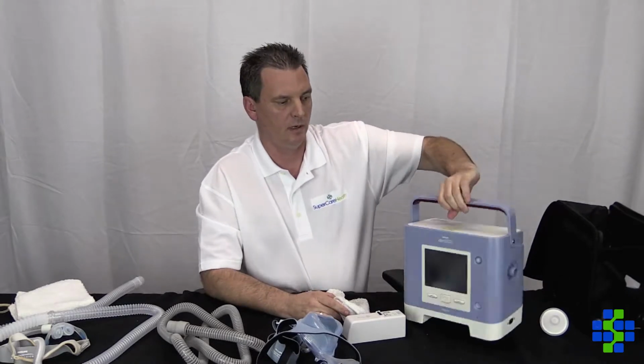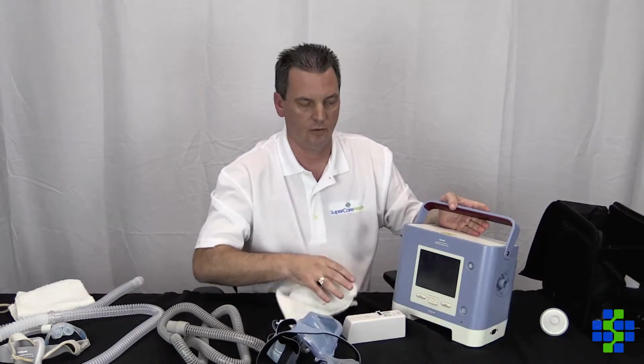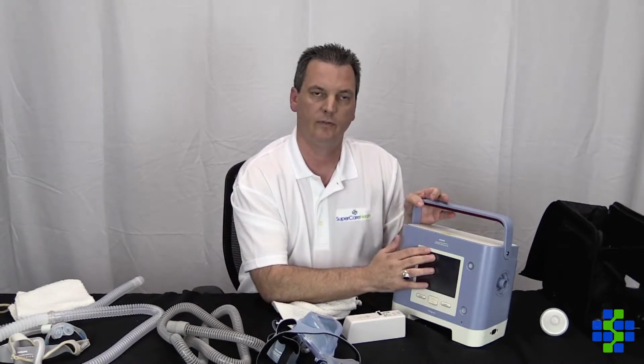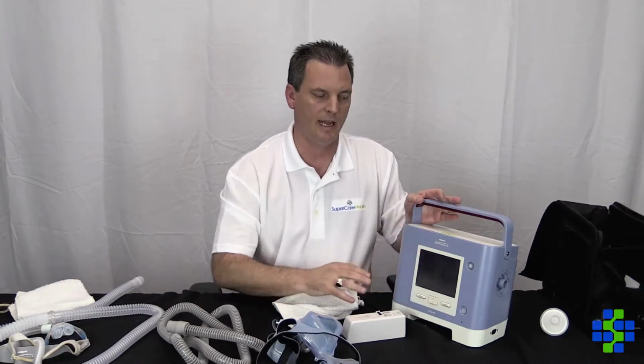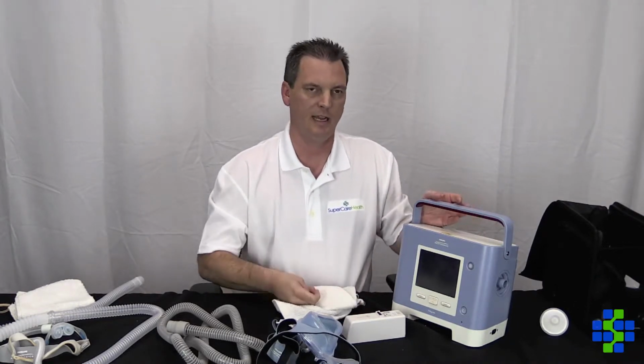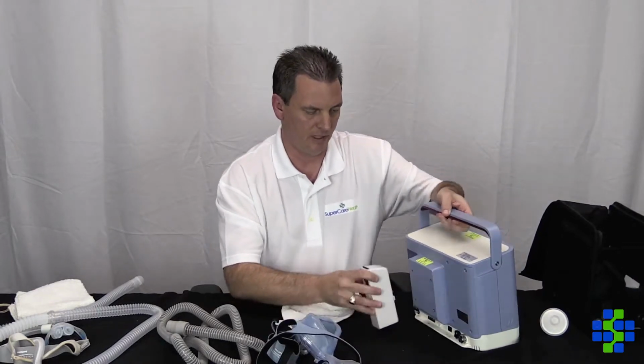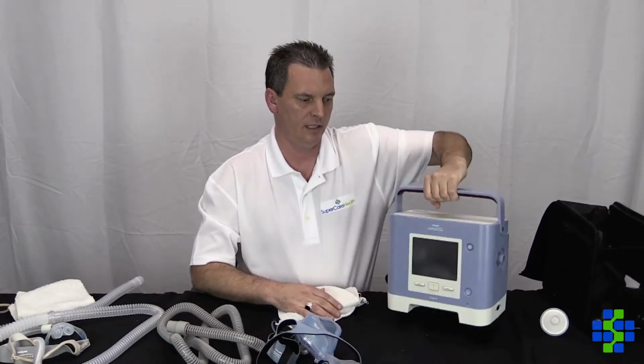After we're done washing it, of course we're going to dry it and make sure that, like I said before, we're not going to use any abrasive cleaners or any Comet, anything like that. So just light soap is a good idea, maybe some Dawn, something like that. And then, of course, once it's dry, we can put everything back in place, and we're ready to use it.